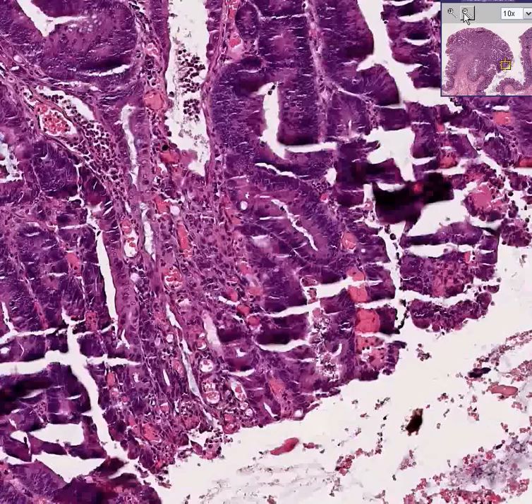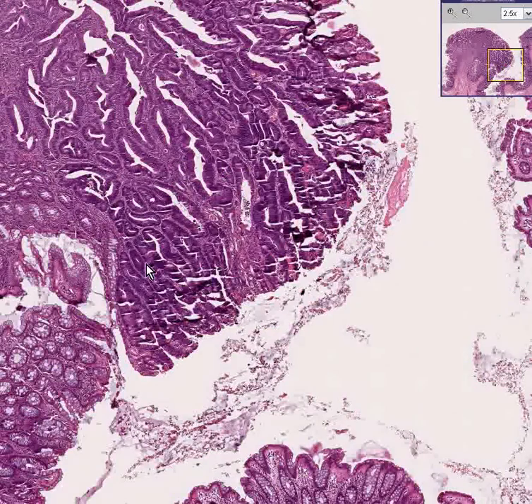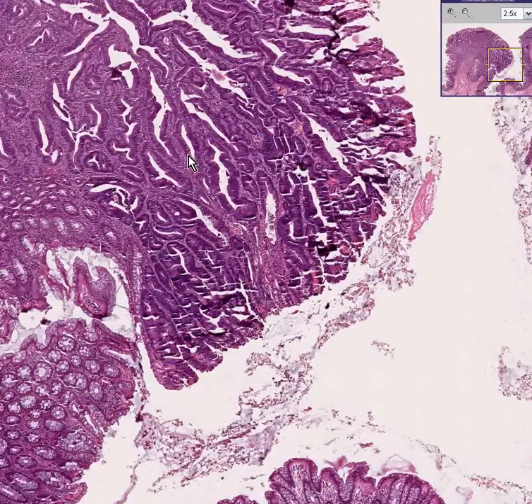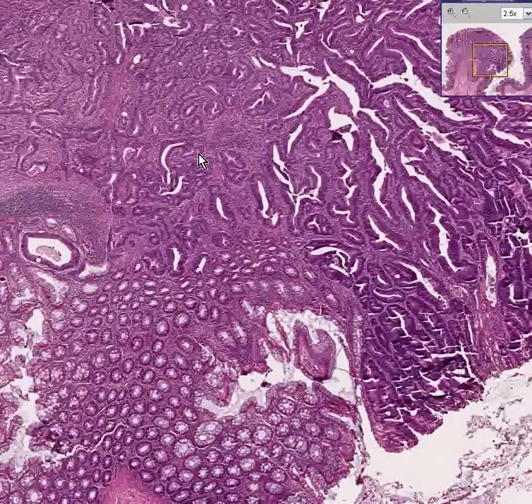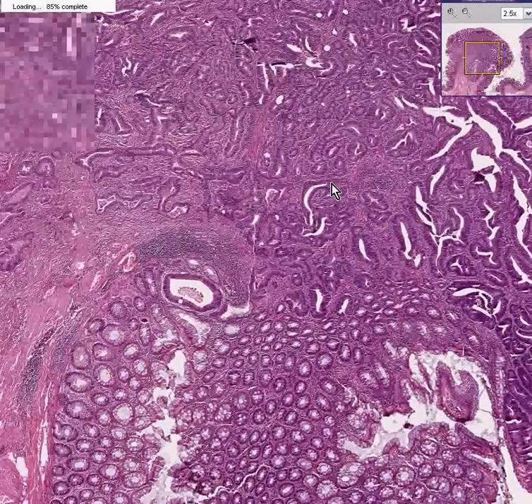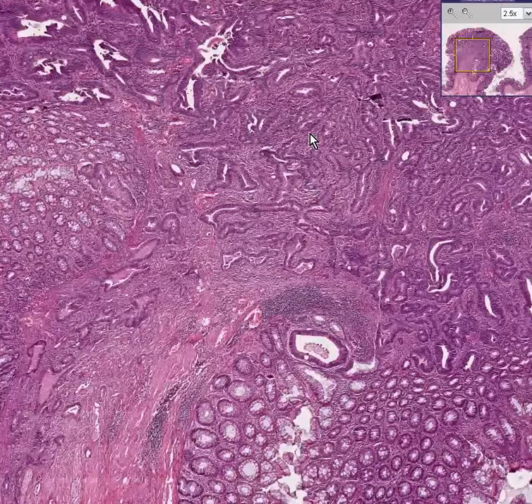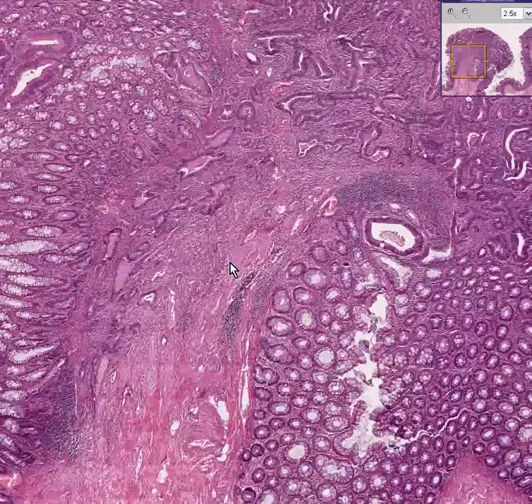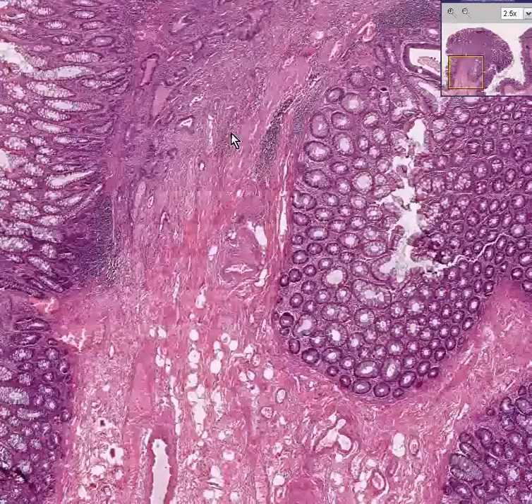Now do you remember when I told you that sometimes these adenomatous polyps can turn into cancer? Well, look what happened.